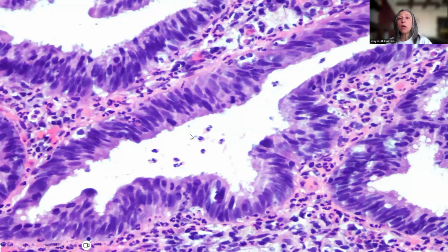This is another focus of the tumor, where we can beautifully see the basal apoptosis here. As you go along the basal layer of the epithelium, you see many of those apoptotic bodies at the basal part of the glandular epithelium versus the luminal place for the mitotic figures. Both of these features, when seen together in a cervical adenocarcinoma, are strong supportive features for HPV-associated cervical adenocarcinoma.